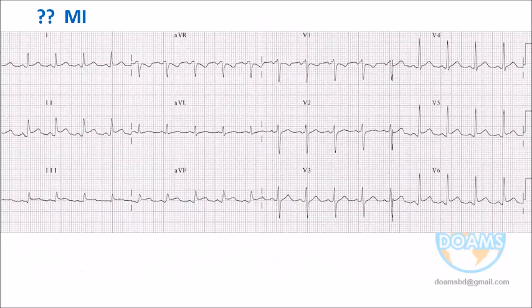2, 3, AVF, 2, 3, inferior, doctor. AVF you are thinking. Possibly all of you agreed. If you don't agree, then interact and discuss. V5, V6, lateral. V5 is lateral. Is there any ST elevation?